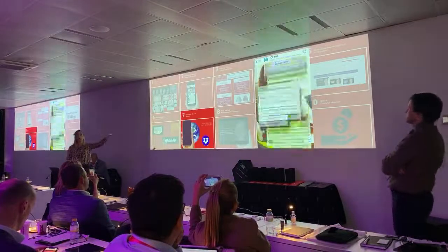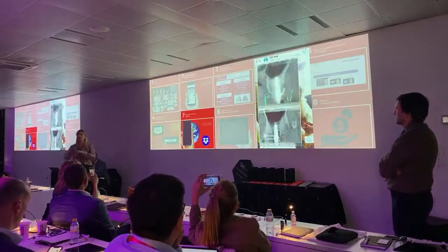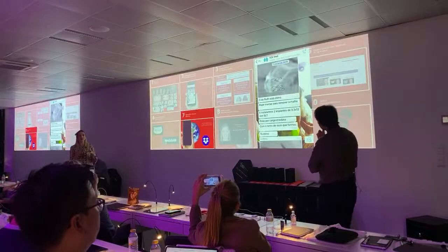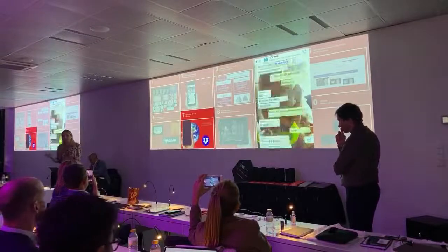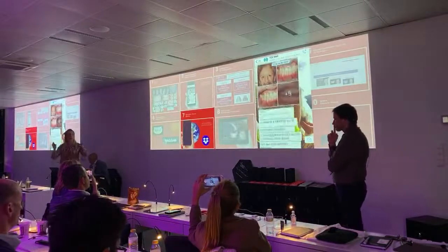And also through WhatsApp, they answer me. Sometimes they record audios. That's enough for my DSD coordinator, okay? She will collect all these opinions and put them in the presentation for me, that is the clinical coordinator, so I can design the final treatment plan with the inputs of the specialists.